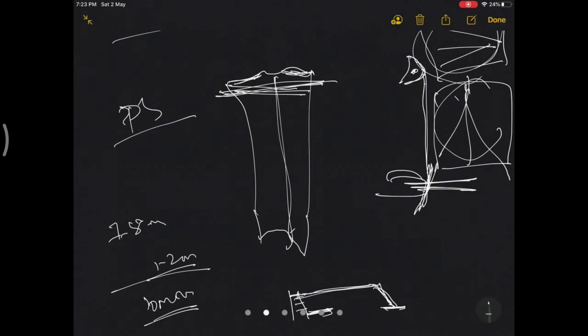If you are planning for an 8 mm cut, you can fix the gradations with this marker to a 6 mm level, with the additional 2 mm considering the lost cartilage. Okay, so this is a bit cumbersome.